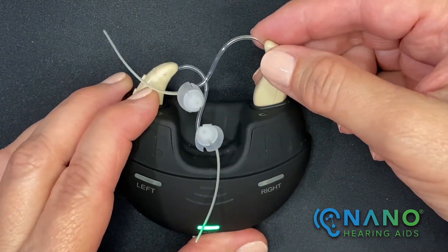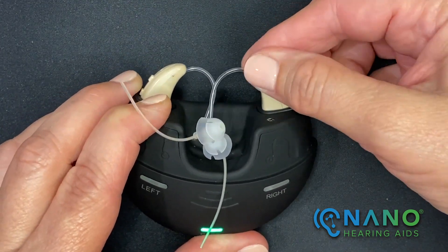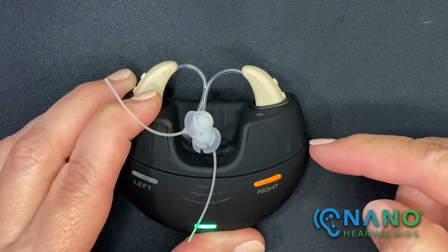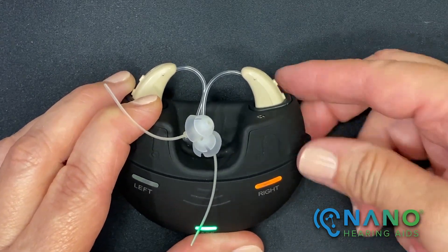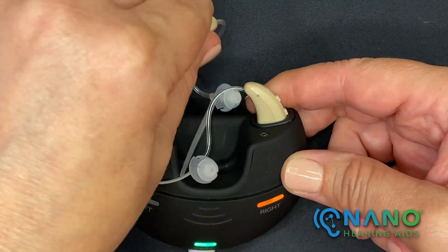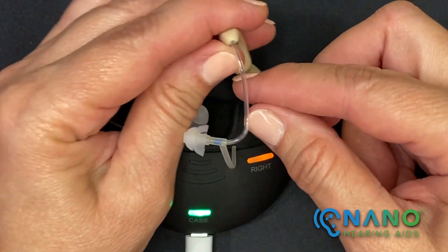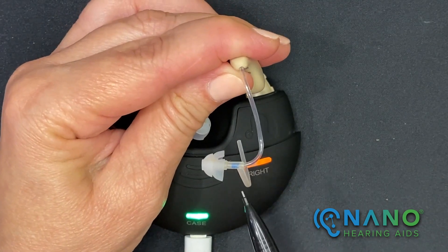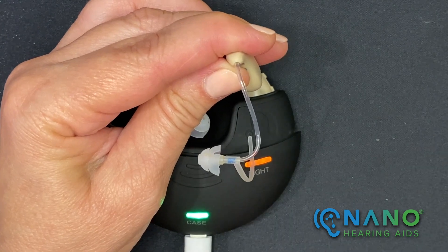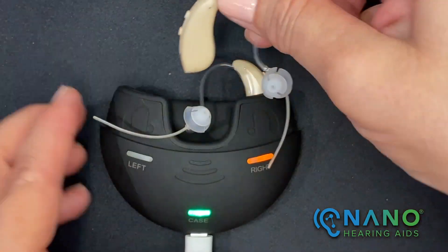When I put the hearing aid back into the charging case, I do need to firmly push it in so the charging contacts can make contact with the case. I'll take the left hearing aid out — the indicators for the left hearing aid are blue. So red is for right, blue is for left.